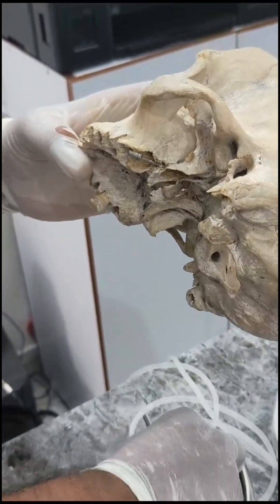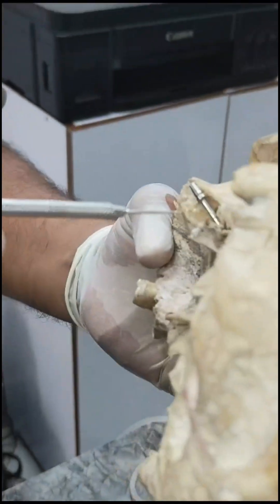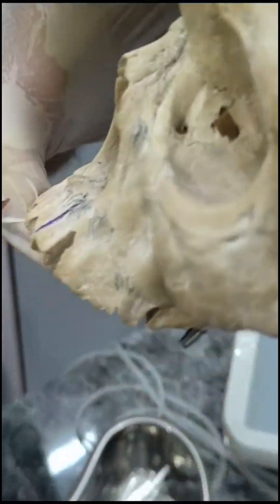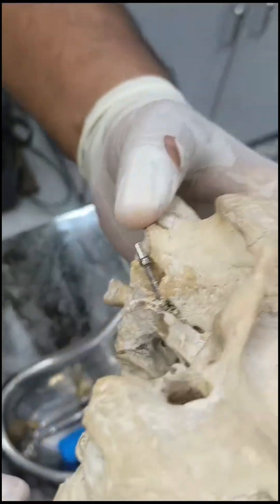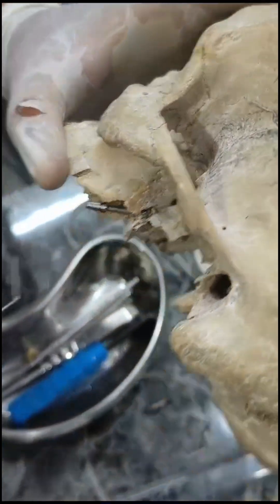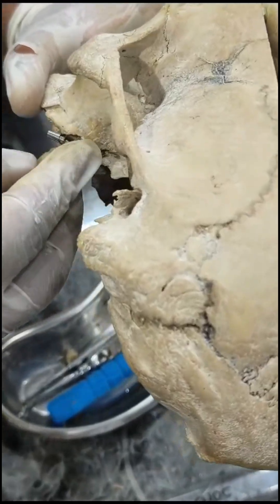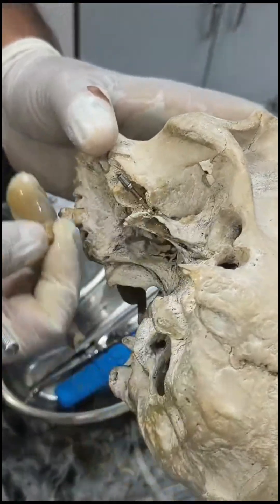I would not advise bending the implant because, as mentioned, due to the dryness of the skull we already had a tuberosity fracture — so if we try to bend it, the implant will come out. But this is a beautifully and clearly done demonstration. If the fractured tuberosity plate were still existent, that would have given us the opportunity to bend the implant.